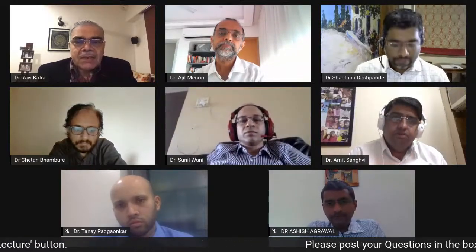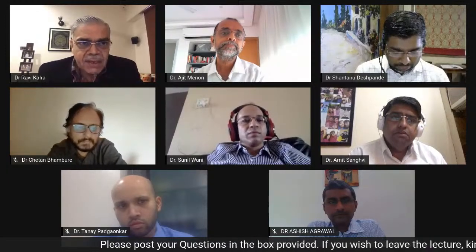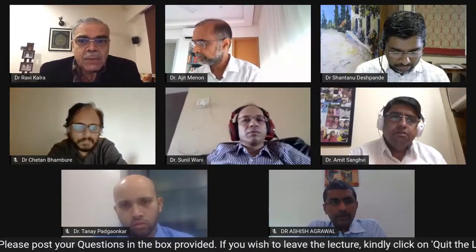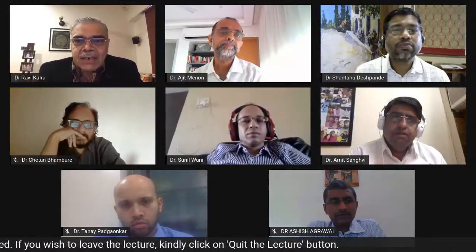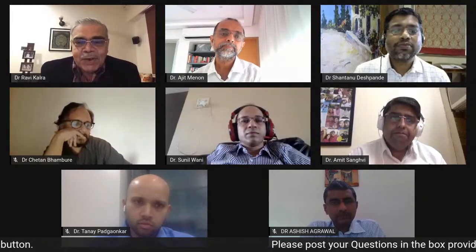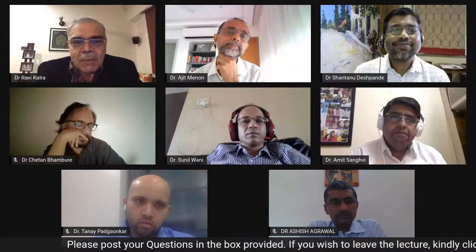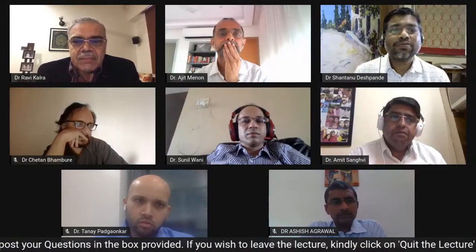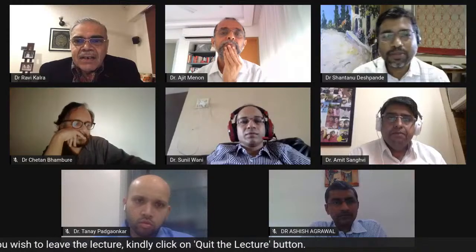I decided not to. To add to Shantanu's point, in uncrossable lesions the burr tends to get stuck more often. Yes, and the 1.25 tends to get stuck more often than the 1.5, although fortunately we haven't had that experience too often. But maybe a 1.5 would have been... What's your comment, Dr. Menon? Yeah, your vast experience of rota ablations.